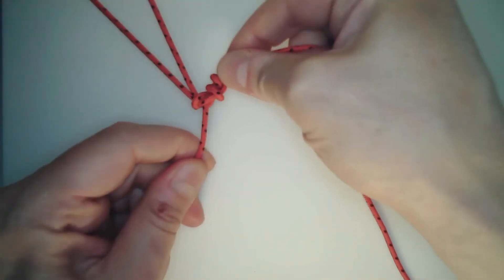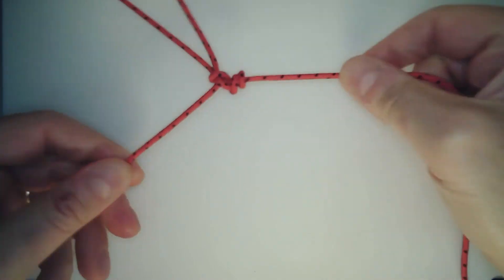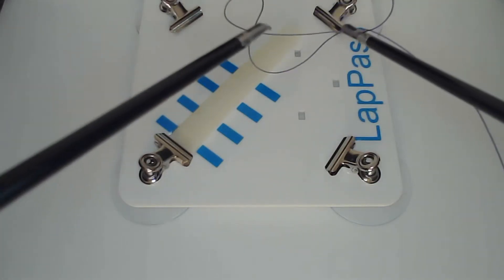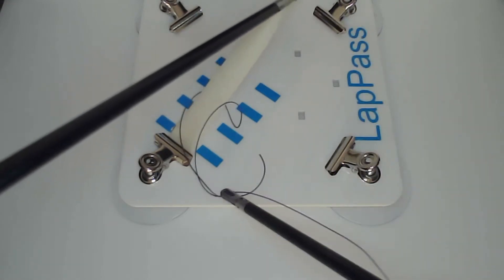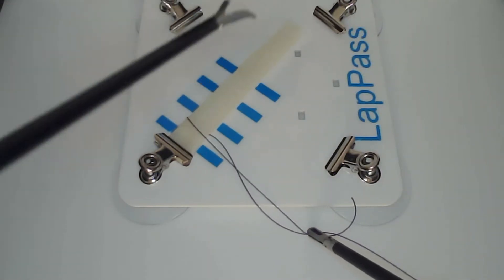The knot can then be slid along and locked at any point. For task two, you have eight minutes to form three of these knots.